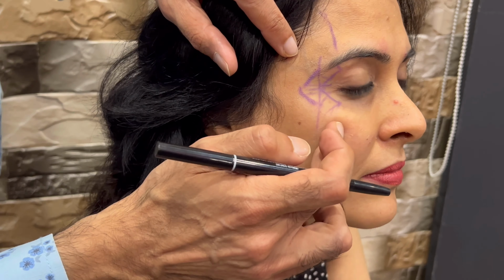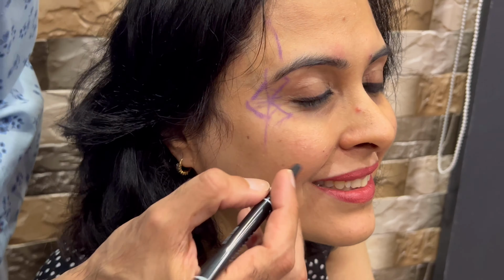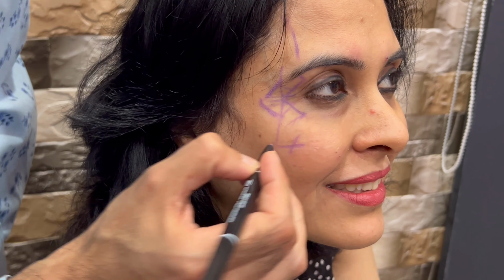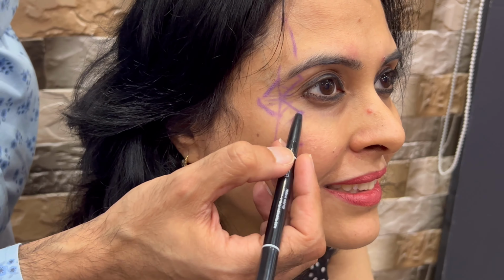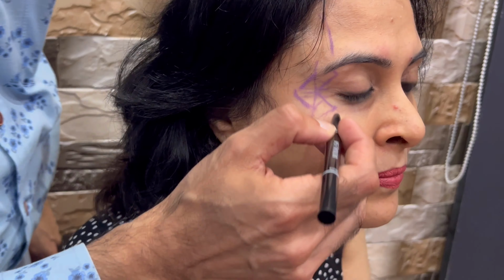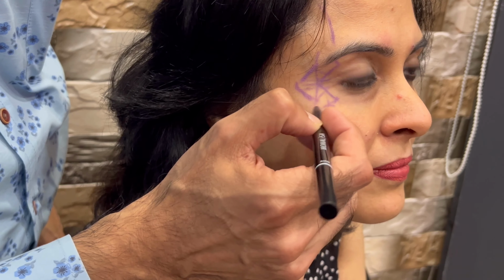See, when she smiles, relax, smile. This is the origin of the zygomaticus major here. This point is very close to this point, and there is a high likelihood that if you accidentally don't inject here but start to inject here, you are going closer to the origin of the zygomaticus.